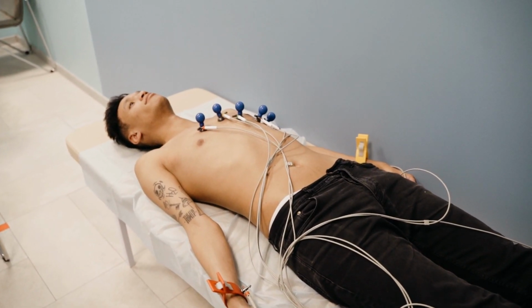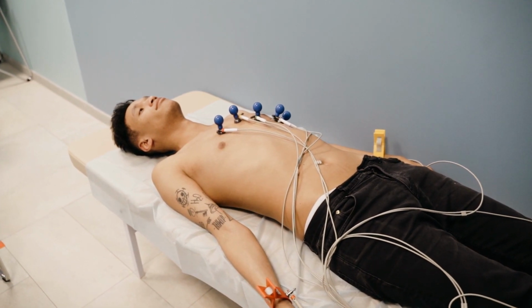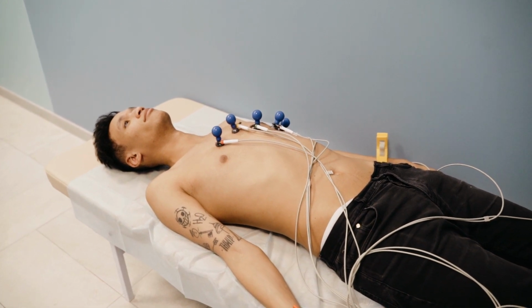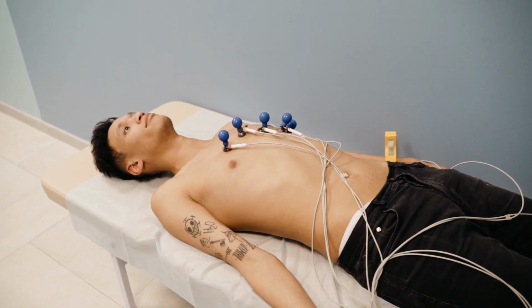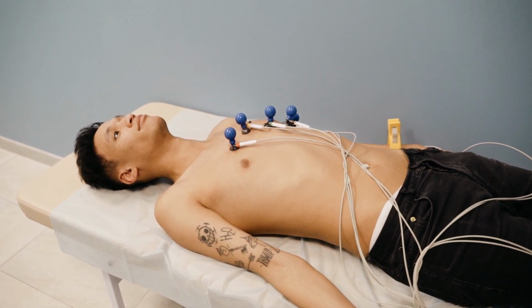Also, patient placement is important. The patient should be lying on the bed, so he or she will be relaxed. Second, you should ask the patient not to speak, not to breathe, because ECG takes several seconds. It's quite possible for the patient not to breathe.